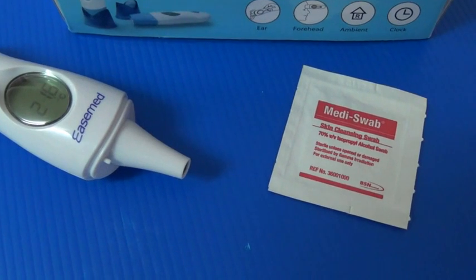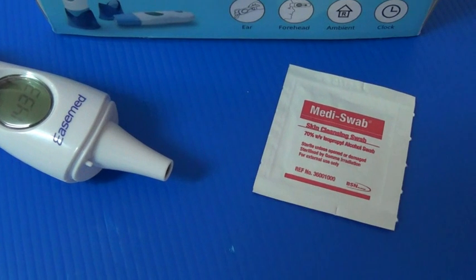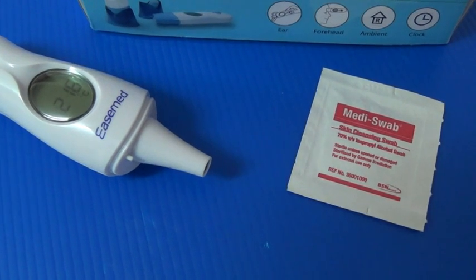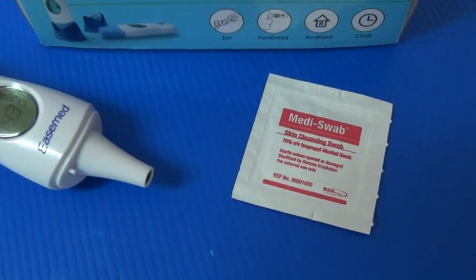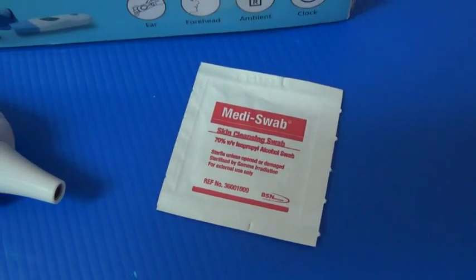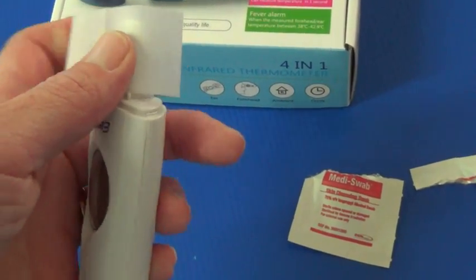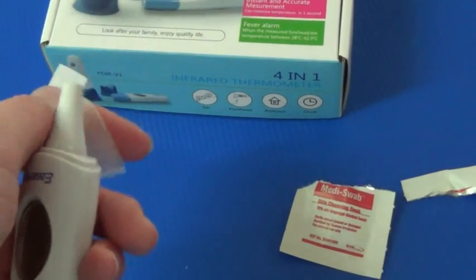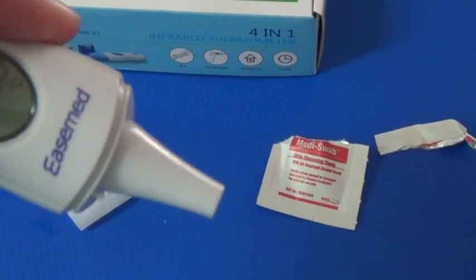The probe tip and the lens are the most delicate part of the thermometer and also the most precise part. It has to be clean and intact to ensure an accurate reading. In order to clean it in between patients, just very gently wipe the surface with a cotton swab or a soft cloth moistened with alcohol. Alternatively, I use Mediswab alcohol wipes — simply take one out of the packet and wipe the tip very carefully. Before using it on your next patient, ensure that there is no moisture left on the tip and it is completely dried out.